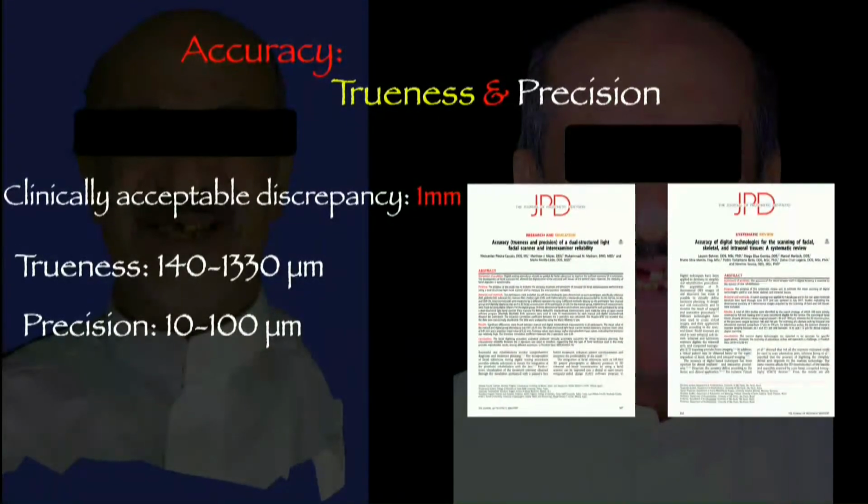So let me rephrase this. If you are using commercially available scanners, you are consistently inaccurate. Now, keep in mind, this is only for facial features.